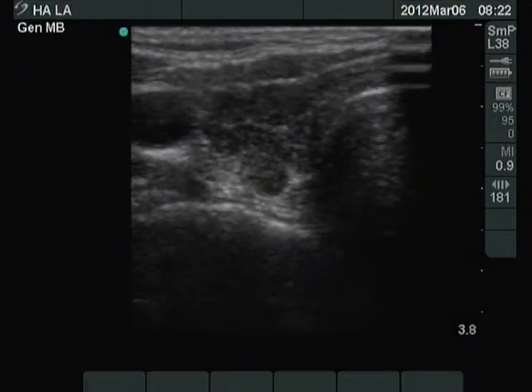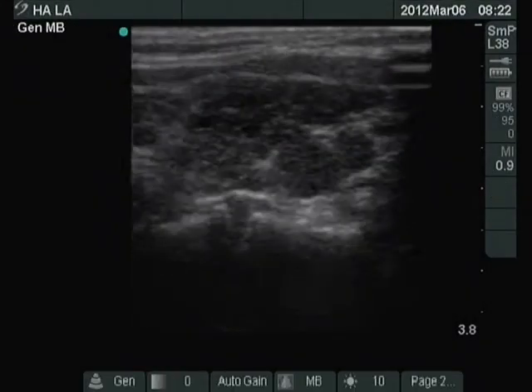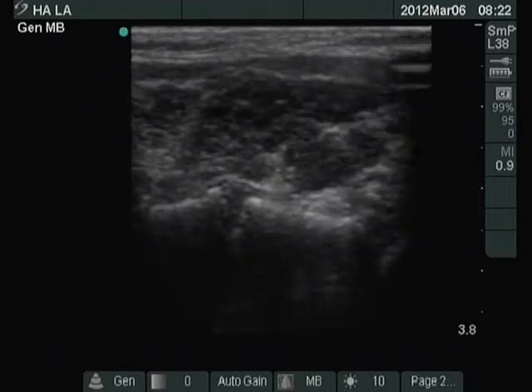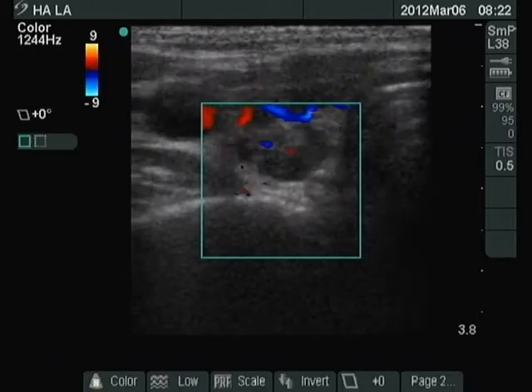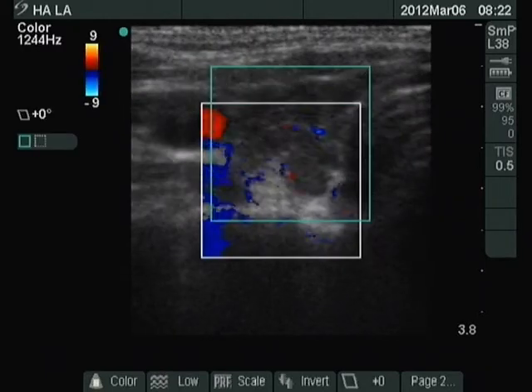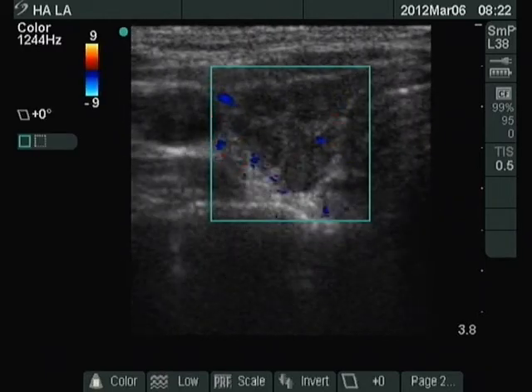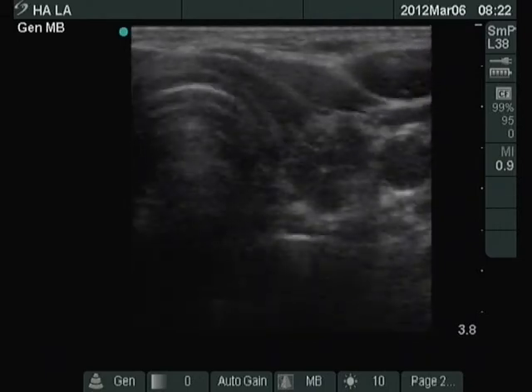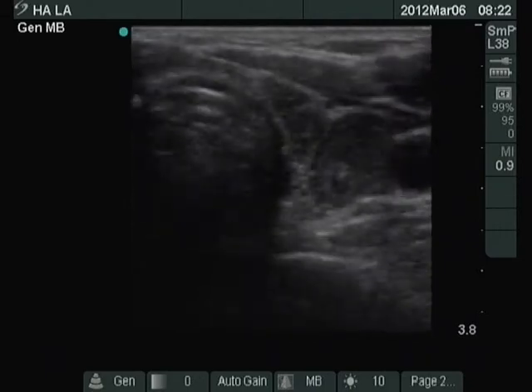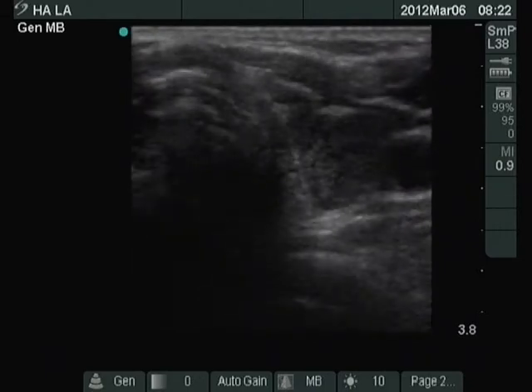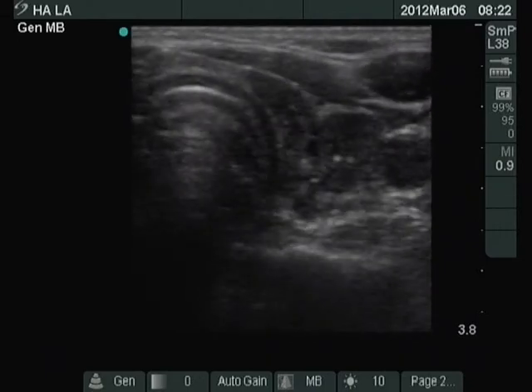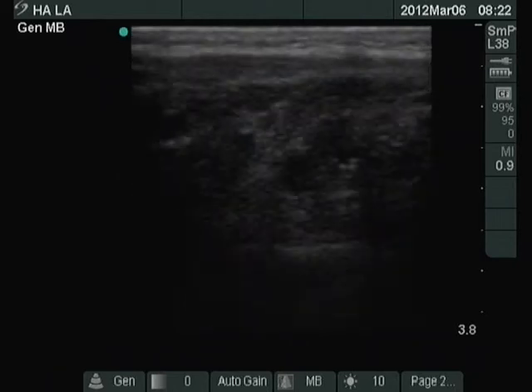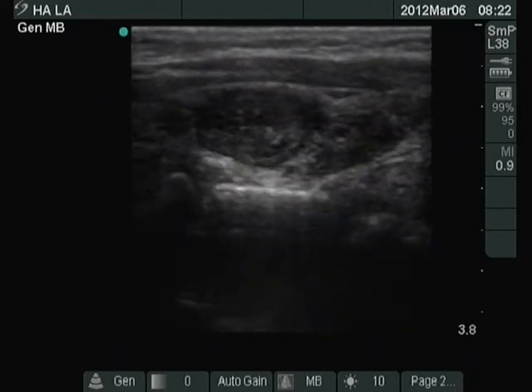Right lobe horizontal view. We can see the typical sonographic pattern of Hashimoto's thyroiditis — a hypoechoic lobe with fibrotic changes. Here we can see the nodule or nodule-like lesion in the lateral part of the left lobe.